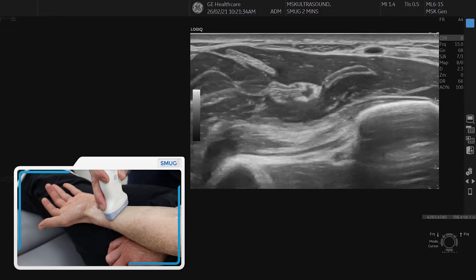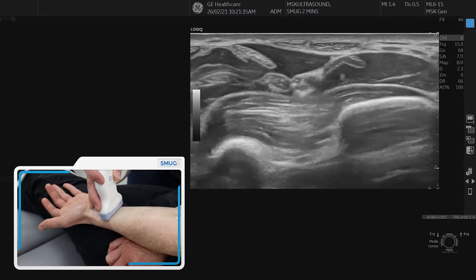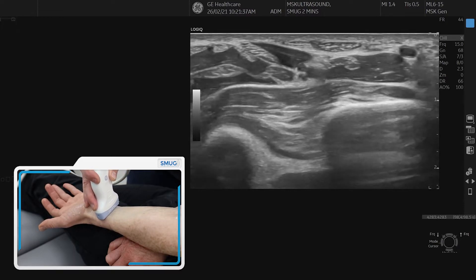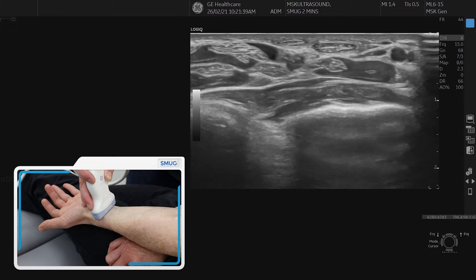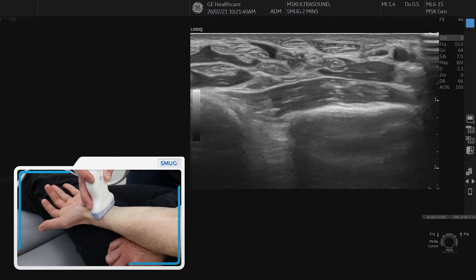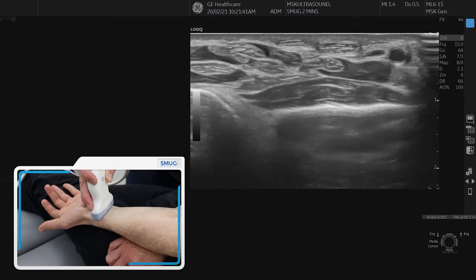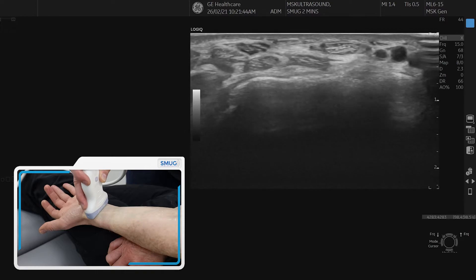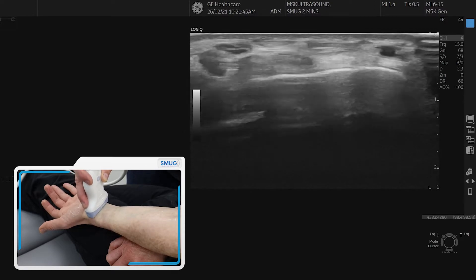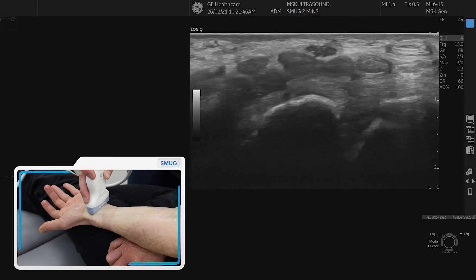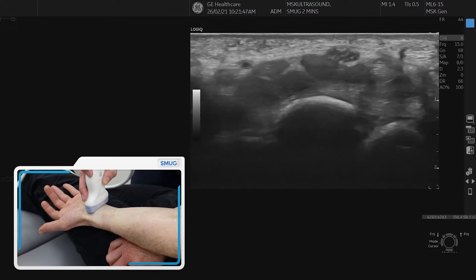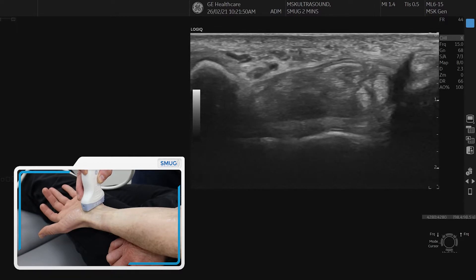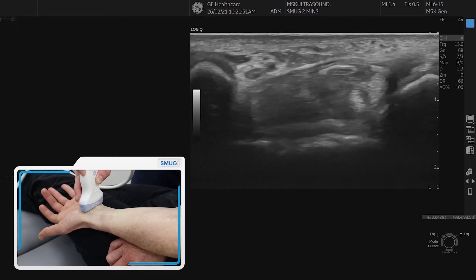You can see it starts to become more superficial and becomes a bit hypoechoic — you can change the angle of course — and it wraps around the tendon, becoming superficial to the tendons just before it goes into the carpal tunnel. Now it lies on top as we get to the carpal tunnel itself.